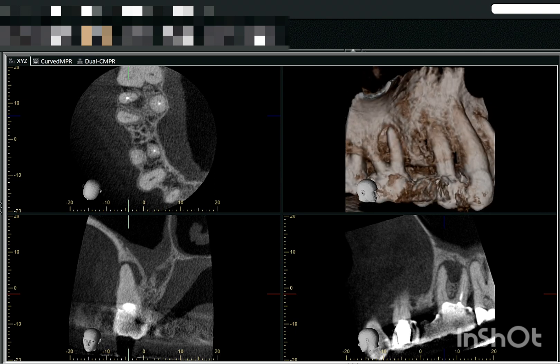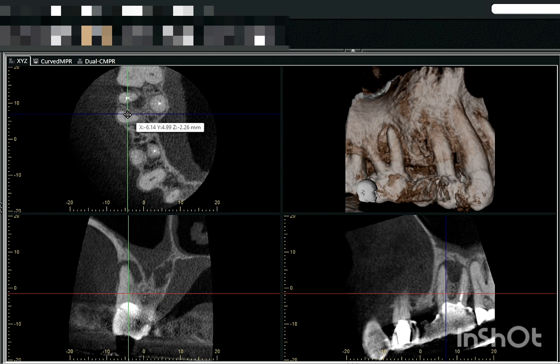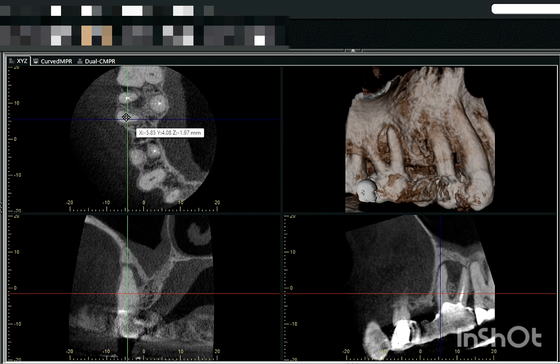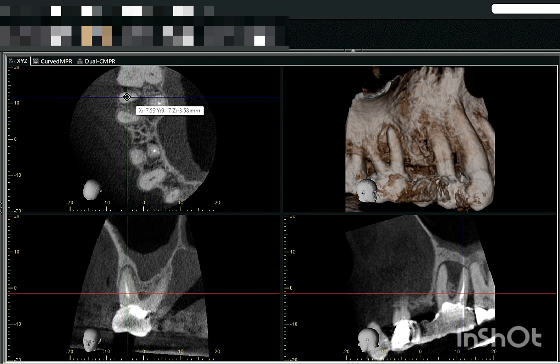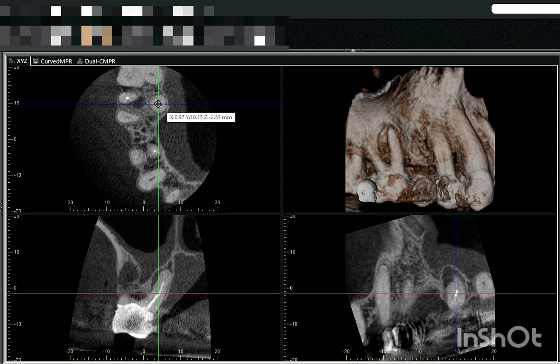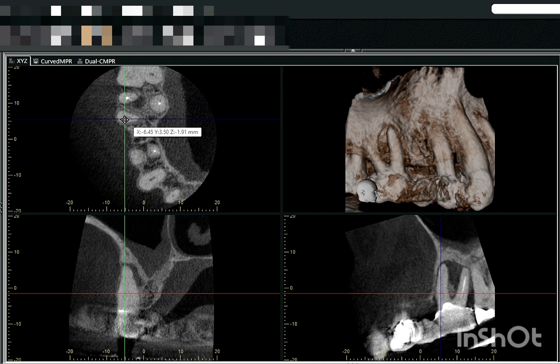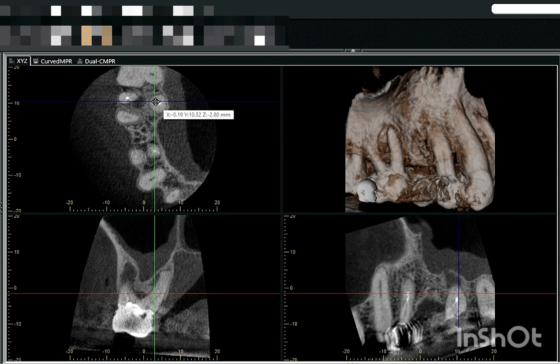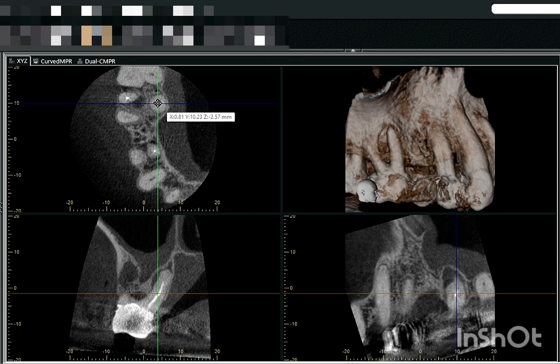As you can see in this scan, this is the mesiobuccal root of 1,6, the distobuccal root of 1,6, and the palatal root of 1,6 — mesiobuccal, distobuccal, and the palatal root.